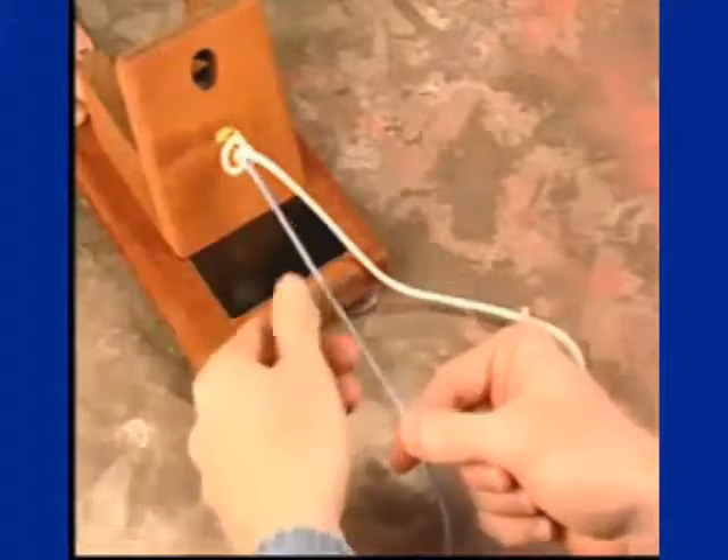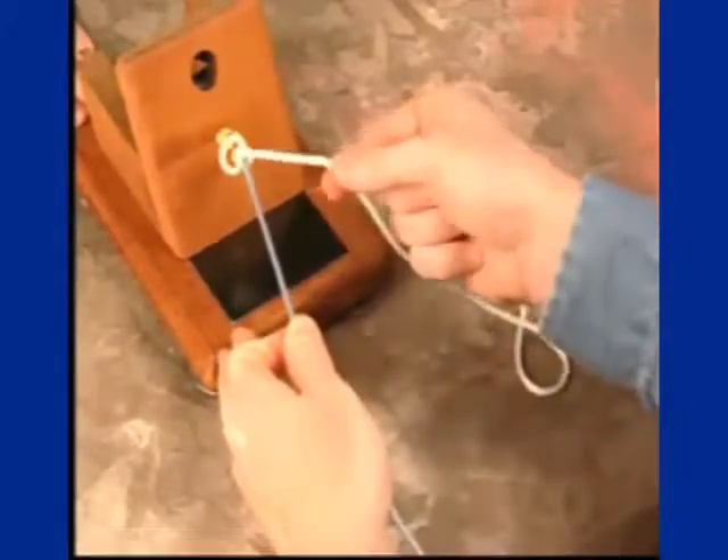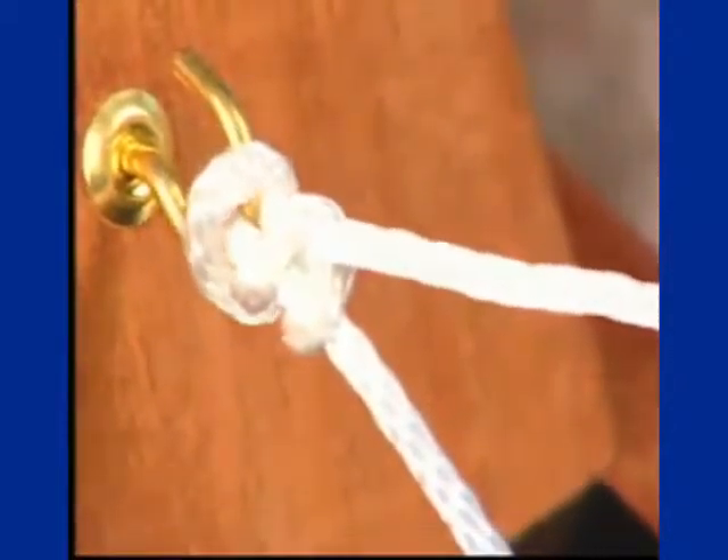Maintaining tension on your post limb, tension is placed on the loop limb. This subsequently tightens the knot, essentially locking it, securing it against the tissues.